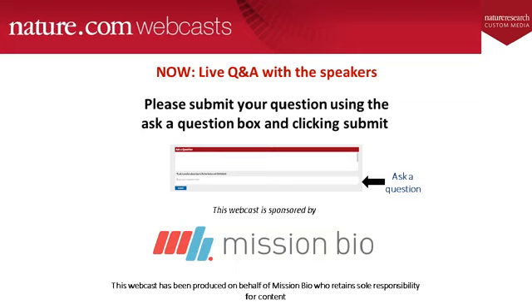We really don't support the use of custom reagents. What we do offer is the ability for investigators to design custom targeted sequencing panels, so they can provide genomic coordinates pretty much anywhere in the genome, and we very efficiently design highly multiplexed panels, and then enable that targeted sequencing panel for an investigator-specific application.